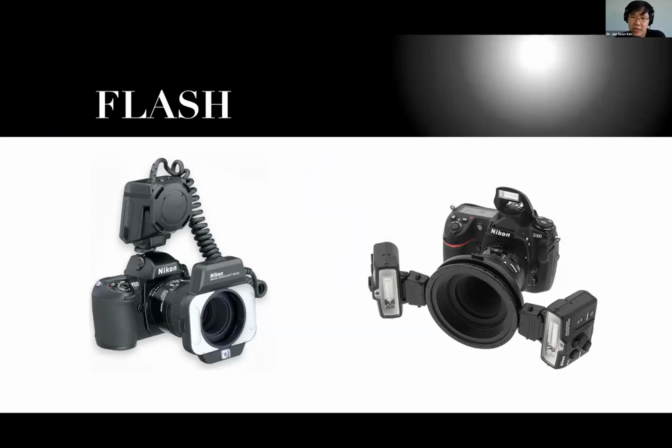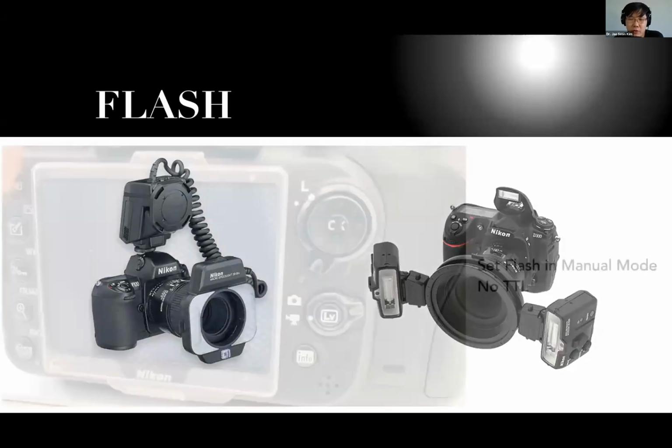It gives you a really good illumination back there, so it's a very convenient form of flash system to use. I personally use the twin flash system because it's more flexible, and it actually makes the workflow in my restorative practice a lot easier. One thing I noticed when I got out of school and got into private practice is I quickly realized that patients are not as patient as they are in school. You can't take a lot of pictures on them for hours. You just have to be efficient, in and out. With the twin flash system, I am able to do that. And I'm going to show you my personal setup that I use, and how it makes the photographic experience much easier.